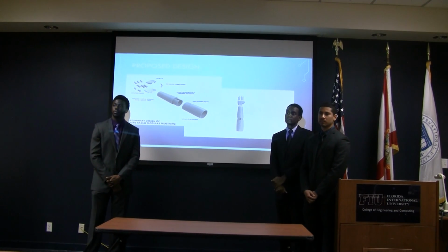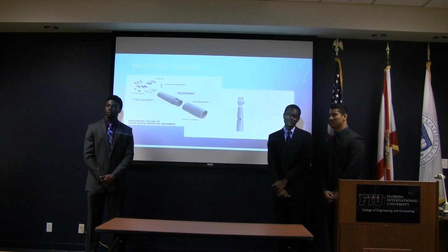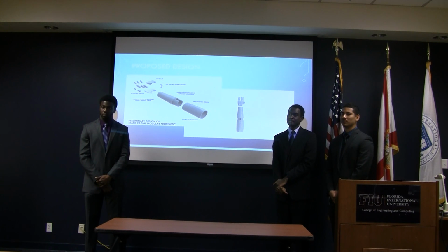I think Dr. Tomanto's suggestion is right on, as we also discussed earlier. Finley has an attachment, a passion for some reason, to create a mechanical hand with 5 fingers, which I couldn't persuade him to get out of. But what Dr. Tomanto says makes a lot of sense: to mechanically make it a functional and modular system.